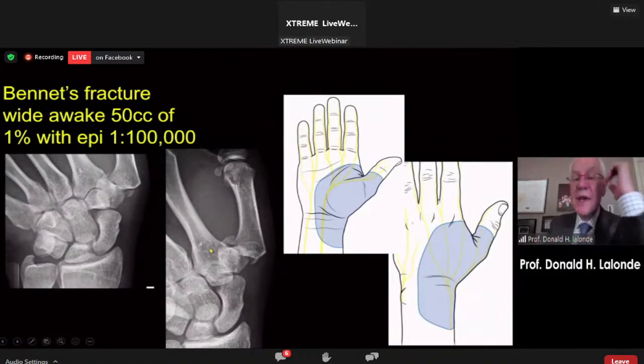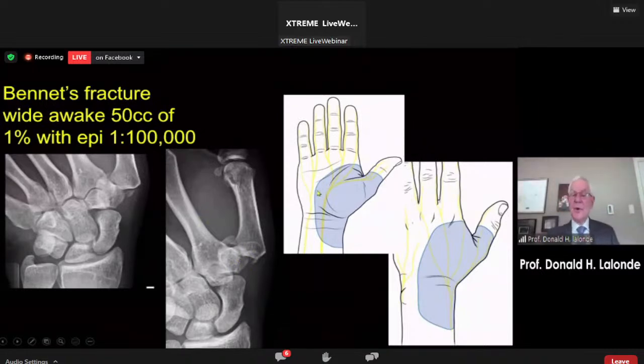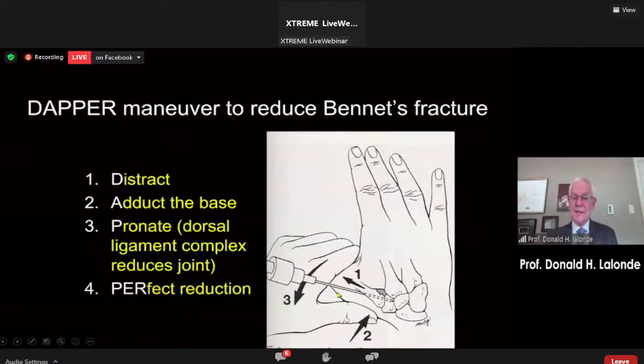So anyway, with a Bennett's fracture, almost always we do not have to open these. This one also has a piece of trapezium off it. And so what I do is I inject the whole radial side of the hand so that I can put K-wires everywhere that I need to, and it doesn't hurt. And I let it work for at least a half an hour, and I see other patients. And then I come back, and this is what I do.